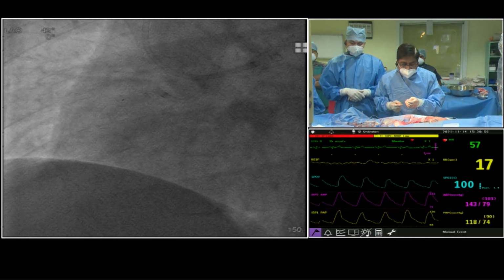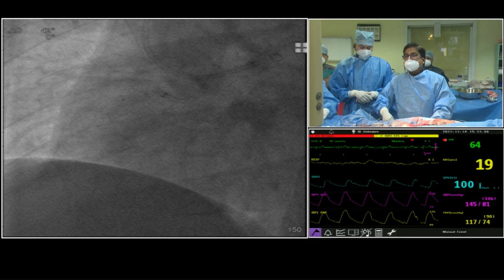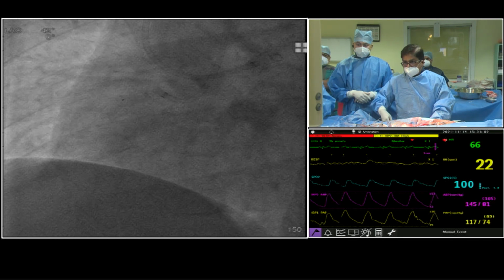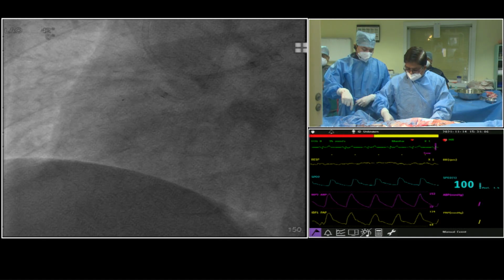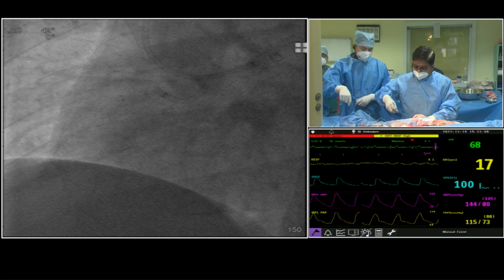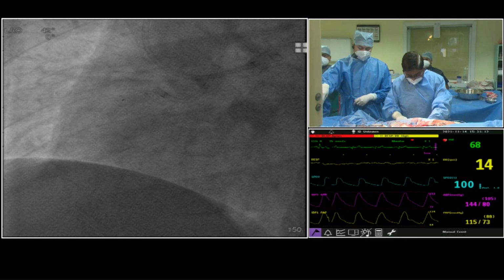The angiogram, I think, was done quite a long time back, about 6 months back. So whatever you have seen earlier may not be that easy. Okay, I thought it was a current angiogram. No, it was done 6 months back. Let us see. Never mind.